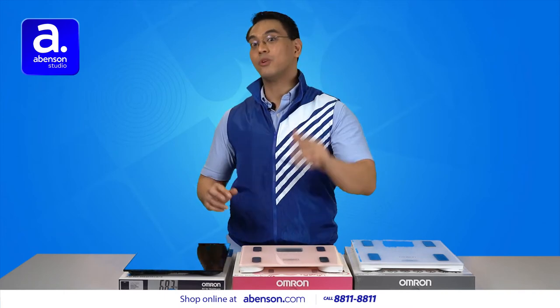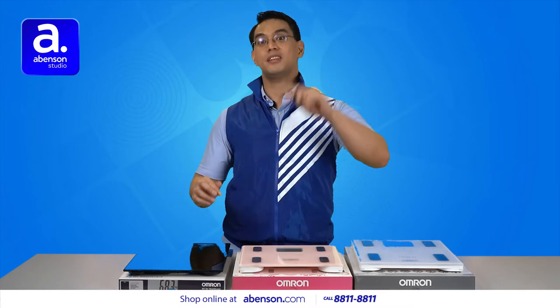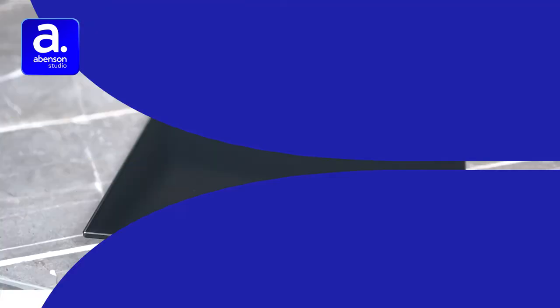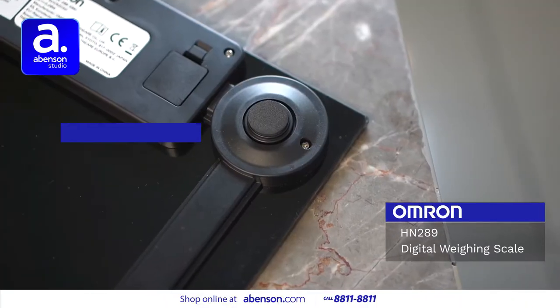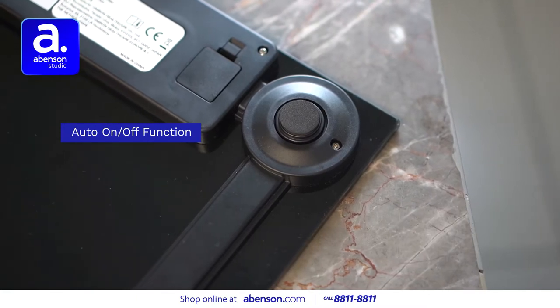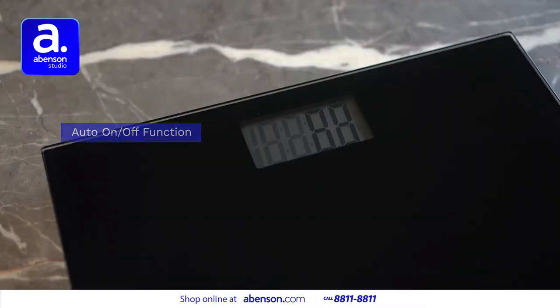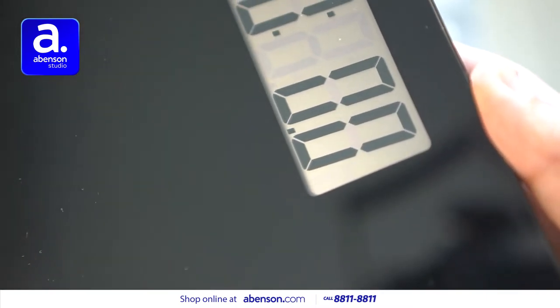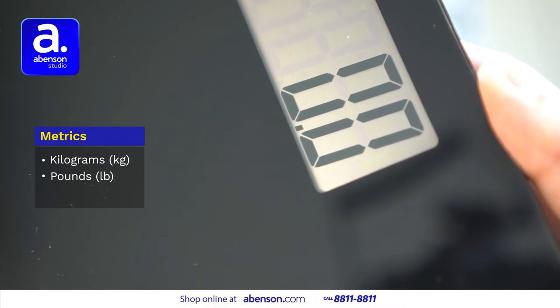Let's start with the most basic one, which is their digital personal scale, HN289. It has an auto-on-off function, so when you step on the scale, it's going to be ready. It has four-sensor technology for accurate measurements, and you can pick the metrics that it uses, including kilograms, pounds, and stone.